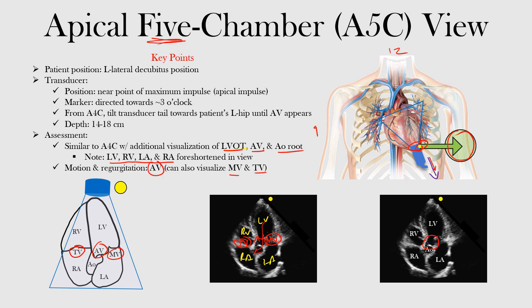Let's review: the patient is in the left lateral decubitus position. Put the transducer at the apical impulse, direct the marker towards 3 o'clock, similar to the apical four-chamber view. From the apical four-chamber view, tilt the transducer tail towards the patient's left hip until the aortic valve appears. Depth can be similar — 14 to 18 centimeters, adjust as needed. The fifth chamber is the aorta, and we can see the left ventricular outflow tract, aortic valve, and aortic root — that's what differs from the apical four-chamber view.